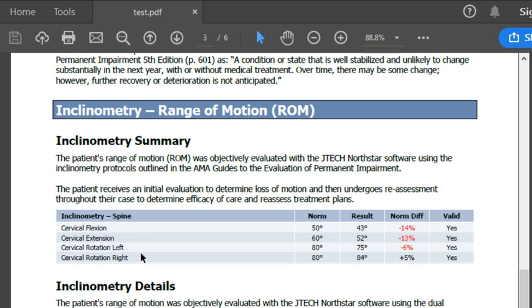So this is another thing that's changed in Northstar, the ability to have a little more control over the degree of specificity of data. So we hear from some users that summary is just what they need, or summary is not enough and they need all the details. We hear from other people that details is too detailed and they'd rather have something a little briefer. We give you the ability now to choose that. In our smart report, it'll actually do both.